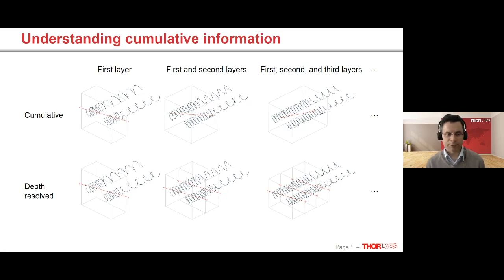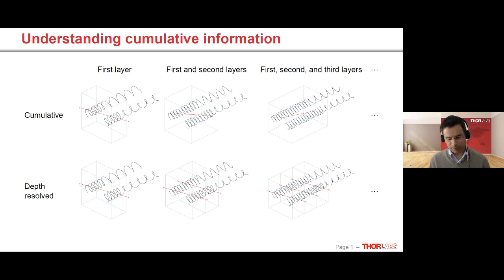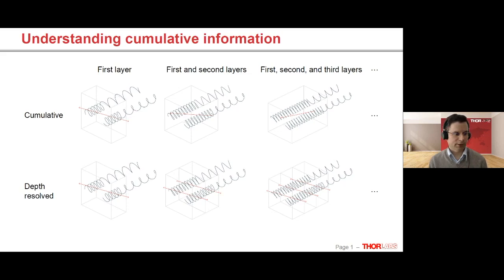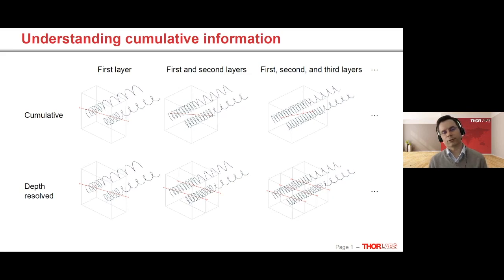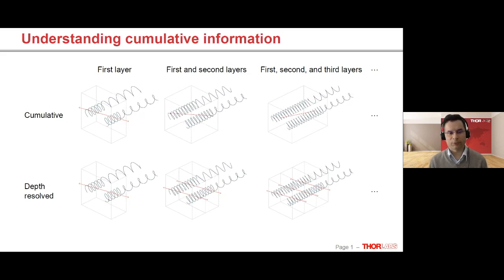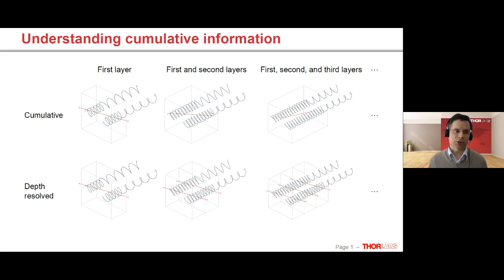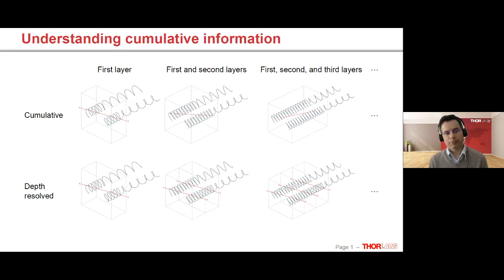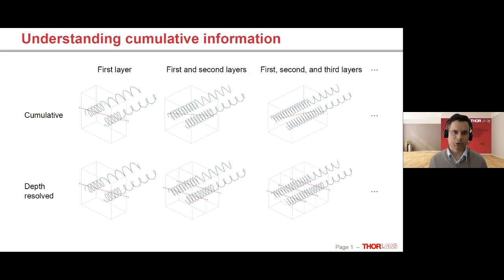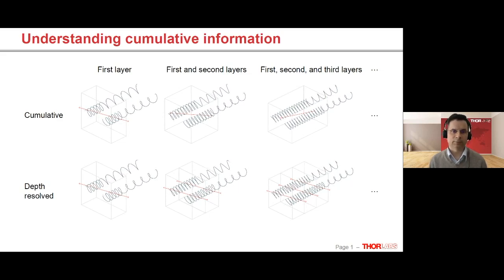Each camera separately has a calibration, because there is a dark current that we subtract, and there are some characteristics of the camera that we take every time or very often when we make a measurement. But it's also related to the way that the light source is changing in time. The way the cameras are positioned stays the same, and we have checked that it stays the same over a long time.